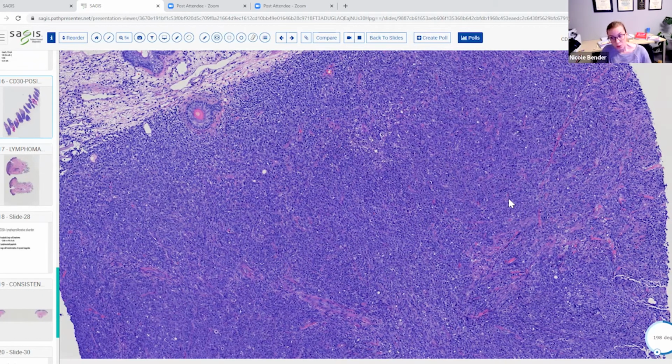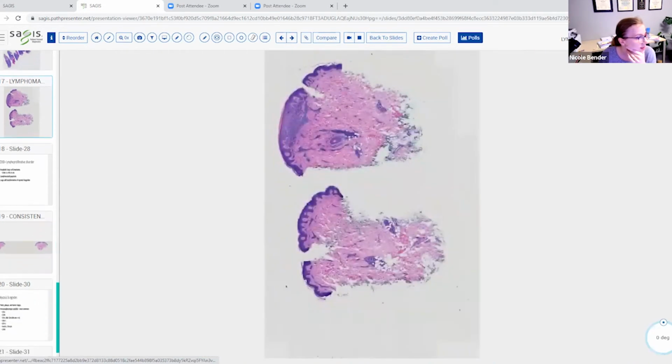There technically are no immunohistologic or morphologic features that can help you in distinguishing anaplastic large cell lymphoma from LYP. However, ALCL does require that at least 75% of the cells are CD30 immunoreactive, while LYP can have a much lower proportion of cells being CD30 positive, as well as even large cell transformation events can have very low CD30 positivity, and that actually requires more of the number of large cells that you see. So ultimately, clinical still guides you in this diagnosis. That's anaplastic large cell lymphoma.